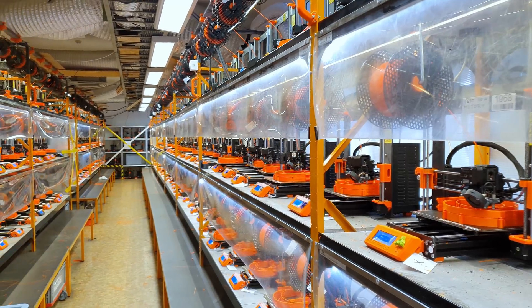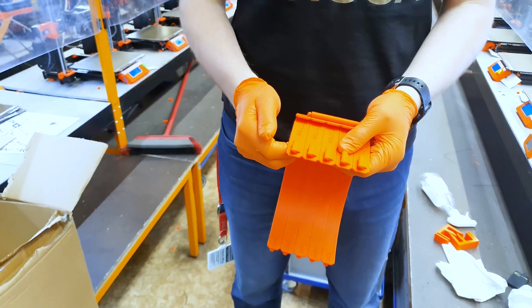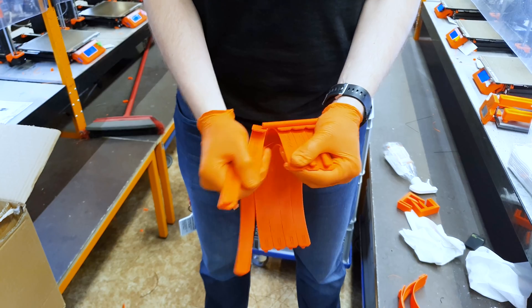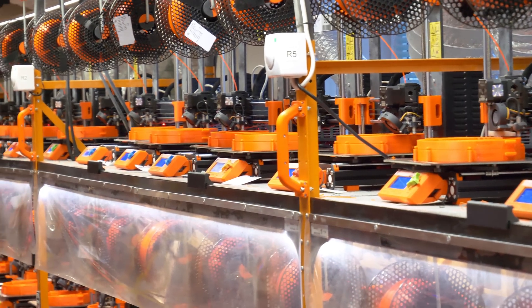Another improvement is printing two to four parts stacked on top of each other. Then they just break apart and we have two separate headbands. This maximizes utilization during the night when there are no operators, so printers can just keep going by themselves.